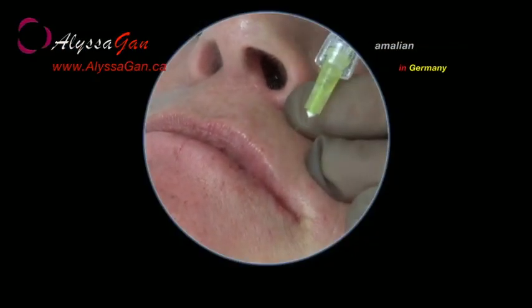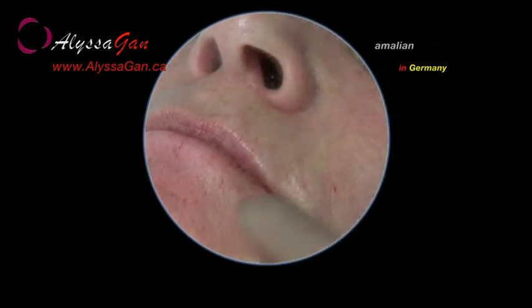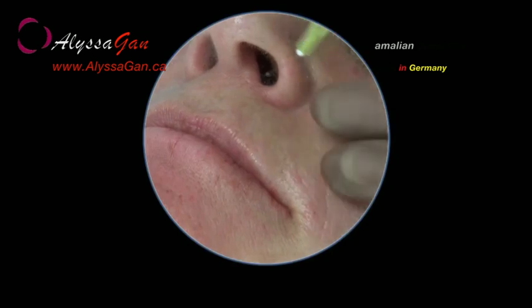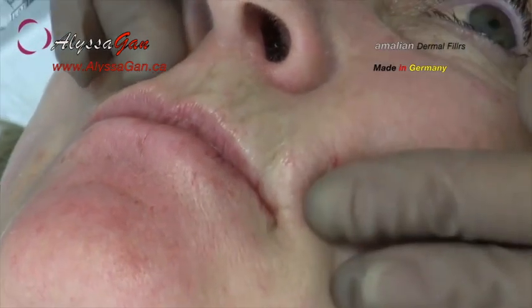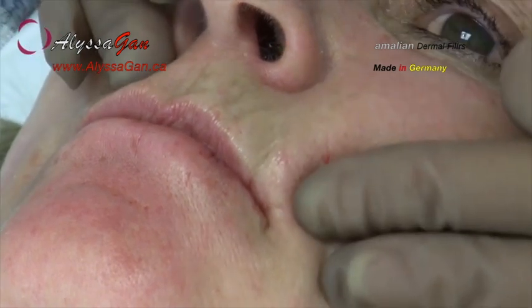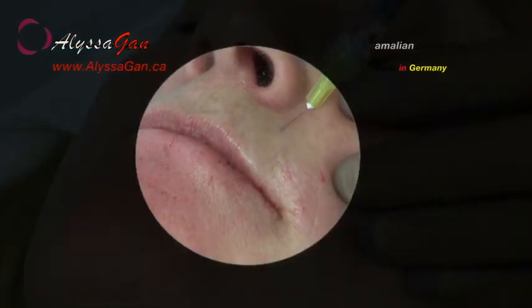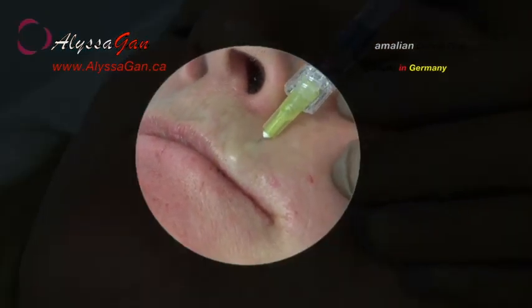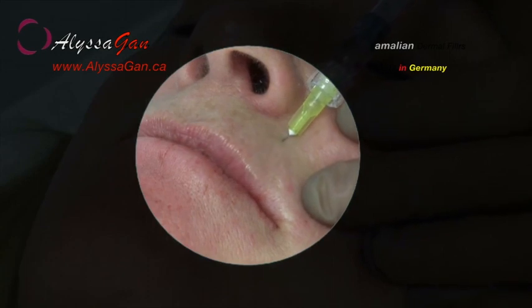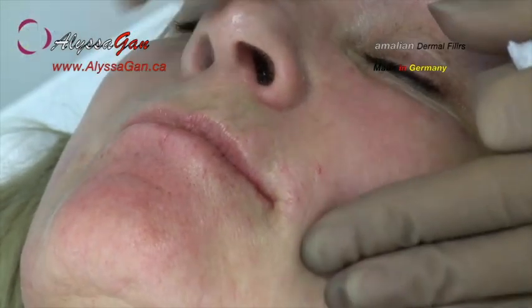In contrast to the lower lip, the fine upper lip wrinkles do not reach into the red of the lip. Obviously, a relatively short time has passed since the last treatment. By squeezing the lip area between the fingers, the physician identifies the wrinkle positions. It is preferable to stand above the patient to be able to perform an optimal visual evaluation of the areas. At the same time, this position is ergonomically favorable for the injection, which can be very easily made along the axis of the injection cannula in this way.